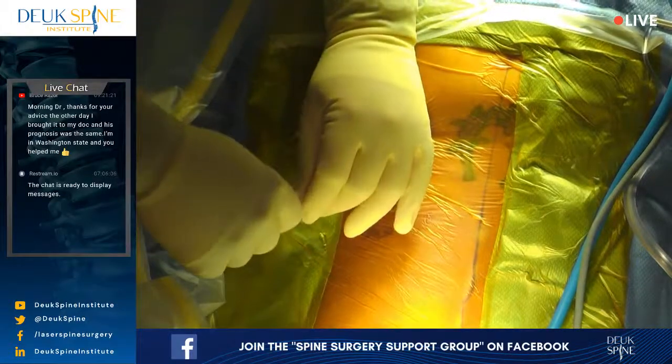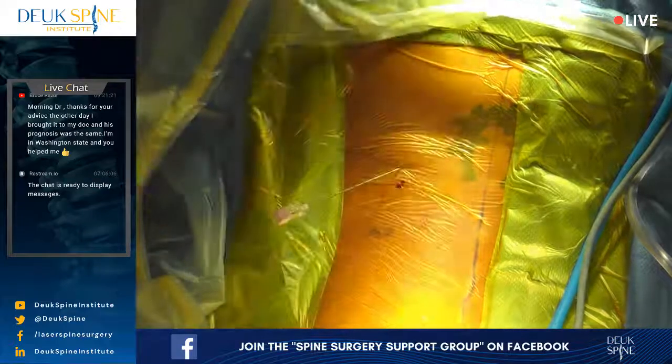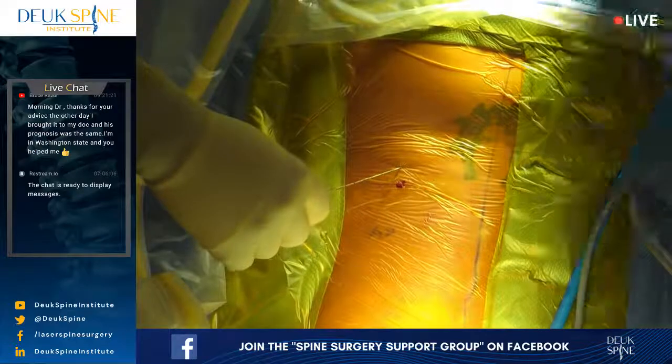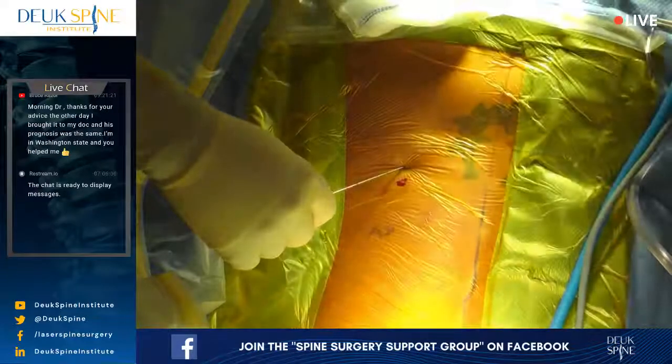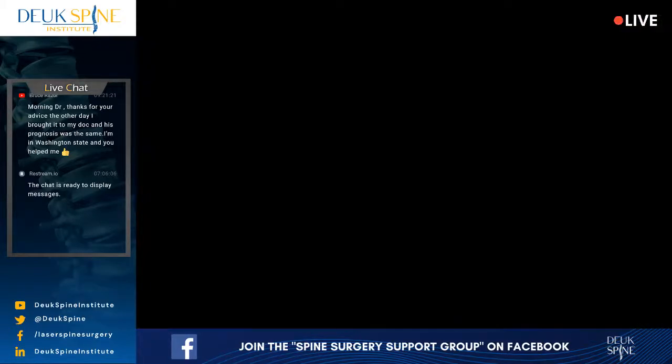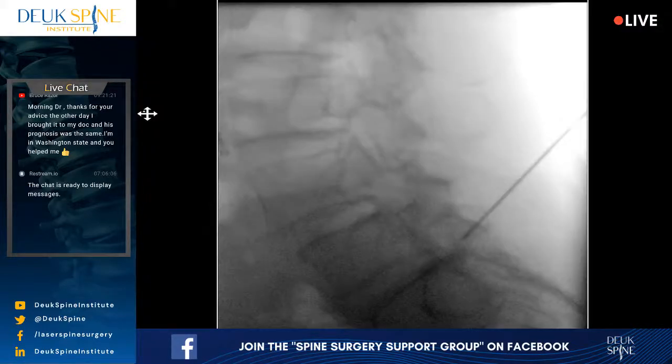So you want to avoid any numbing around the foramen, which we're close, but not quite there yet. You're doing great. Just lay still, okay? Sean, our trajectory looks pretty good. I've just got to figure out if we're too lateral.